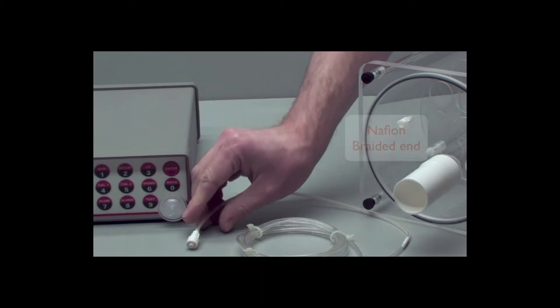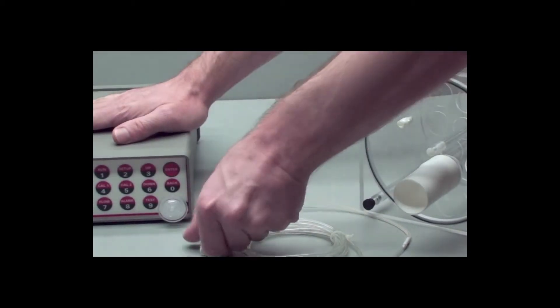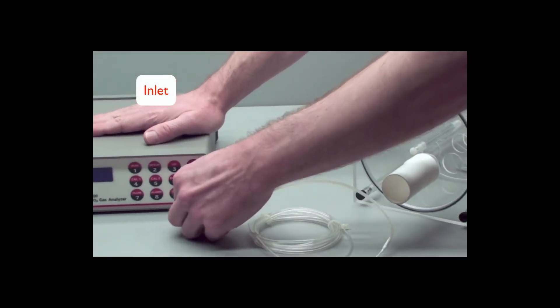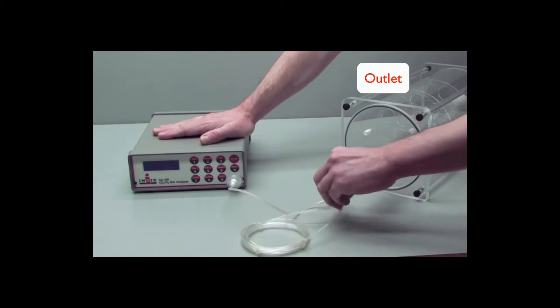Next, take the clear Nafion tubing and take the braided end, and that goes to the front inlet of the gas analyzer. The other end then goes to the outlet of the mixing chamber.